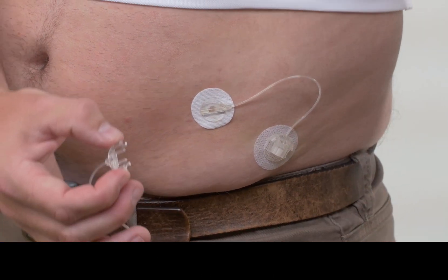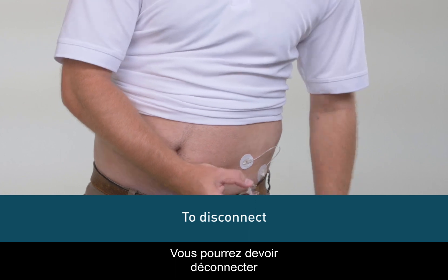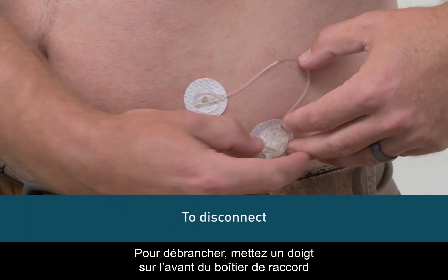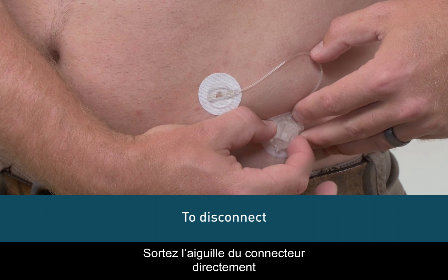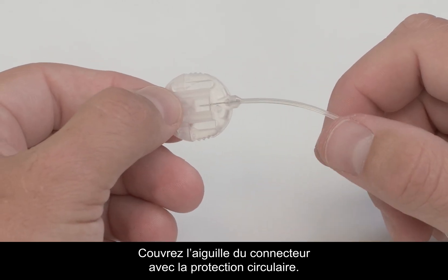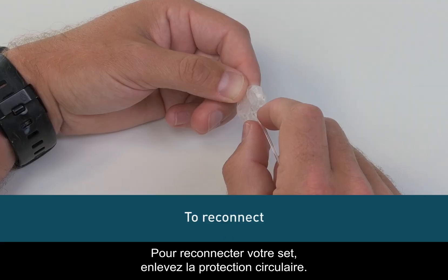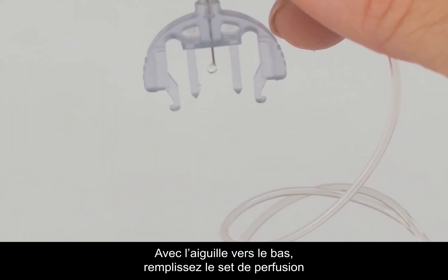When disconnecting from your pump, always disconnect from your site — never disconnect at the tubing lock. You may want to temporarily disconnect from your pump at times such as showering, swimming, and contact sports. To disconnect, place a finger on the front of the coupling housing and gently squeeze the sides of the connector needle. Pull the connector needle straight out from the coupling housing. Cover the connector needle with the circular protective cap, then insert the disconnect cover into the coupling housing until you hear it click.